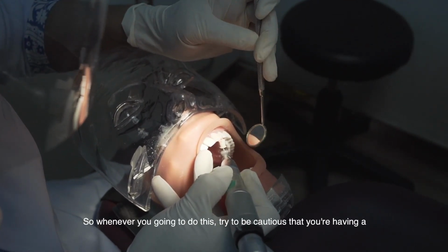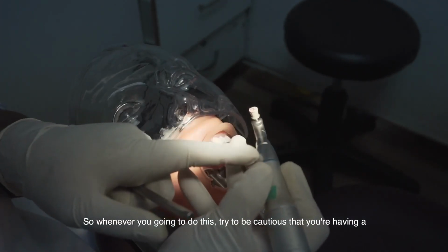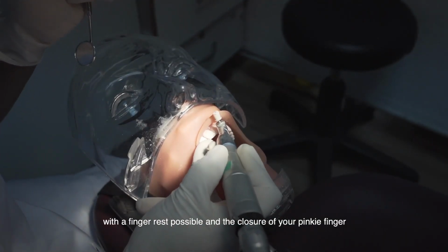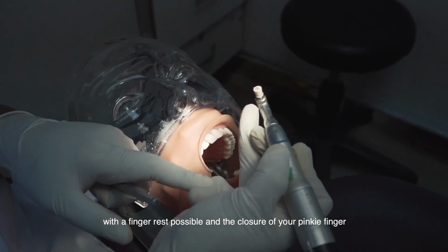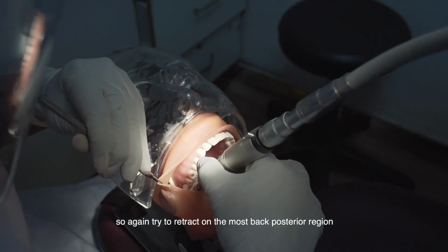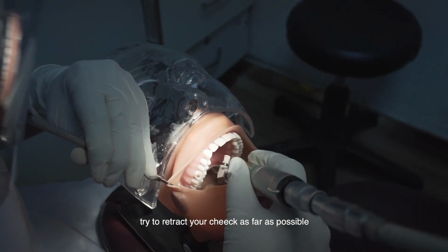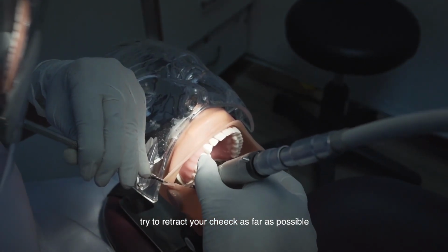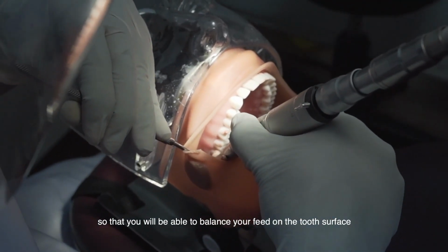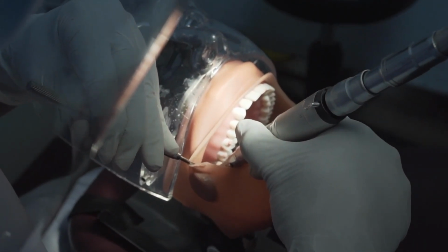Whenever you are doing this, be cautious that you have either a pen grasp or a modified pen grasp with a finger rest and closure of your little finger. Again, to reiterate, for the most posterior regions, try to retract your cheeks as far as possible so that you will be able to balance your instrument on the tooth surface.